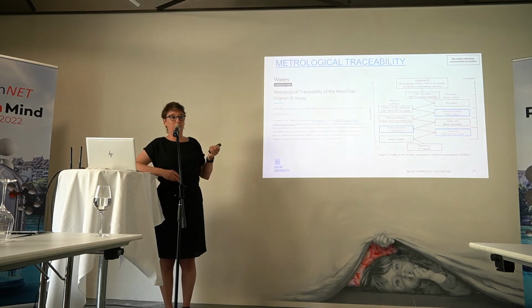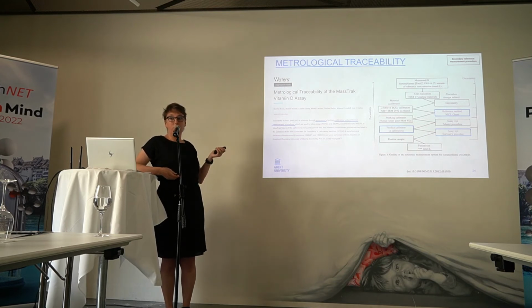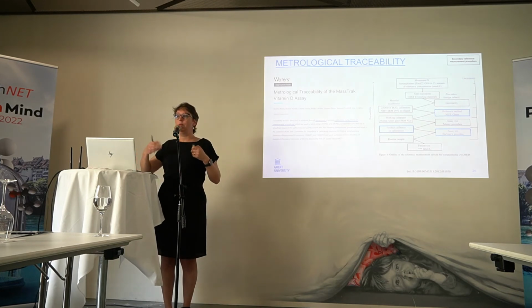And then an example of how we applied it. So Waters has a commercially available kit for LCMS users who want to measure 25-hydroxyvitamin D. And if you would look up their statements on traceability, you will find that they have an assignment of the values of their calibrators by using reference measurement procedures, and then the identification of our methods and the name of my former boss. So that's how we use these secondary reference measurement procedures.